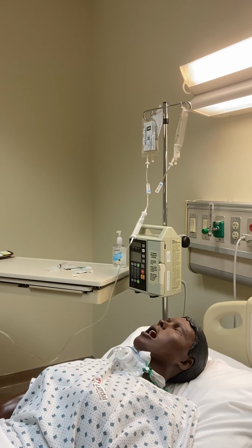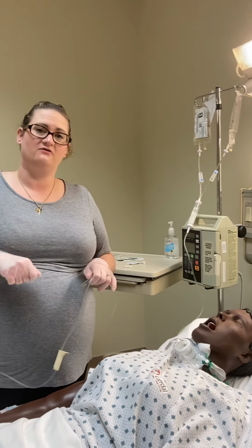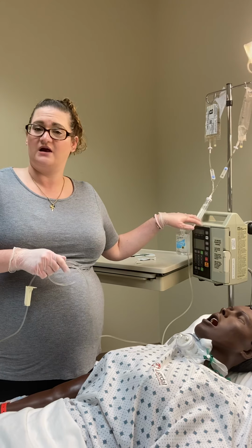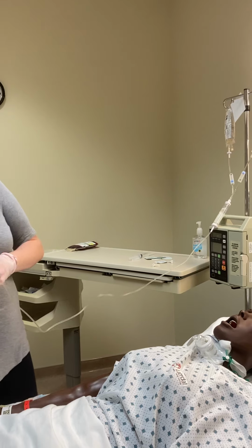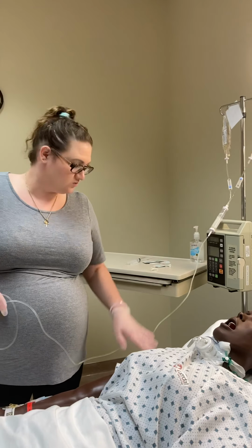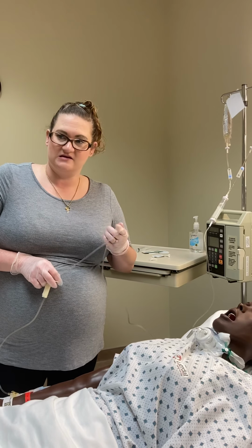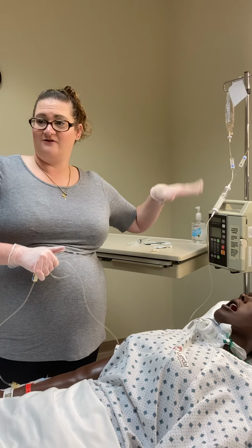And then we would regulate our blood. So we're gonna do 2 mLs per minute for the first 15 minutes, which equates out to 120 mLs per hour if we were gonna put it on the pump. If we are doing it by gravity, which we are, and you'll do your dimensional analysis, 20 drops per minute is what I calculated for how fast I'm going to run this over the first 15 minutes only.